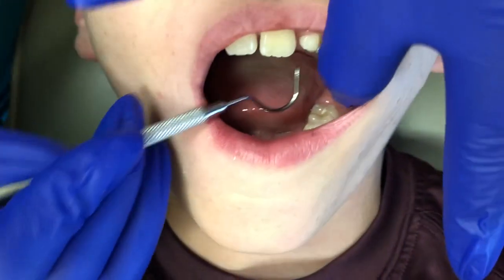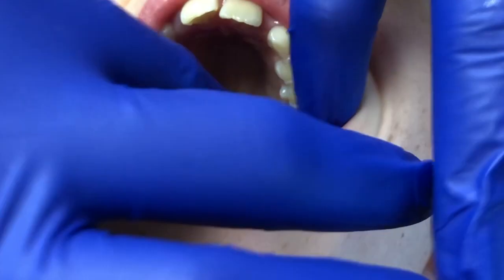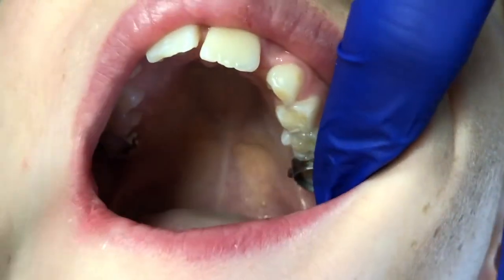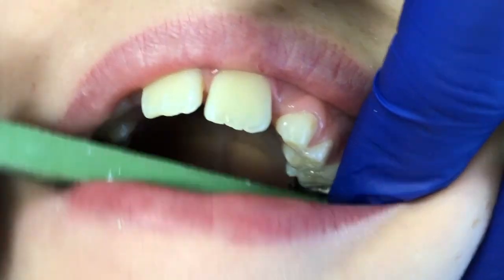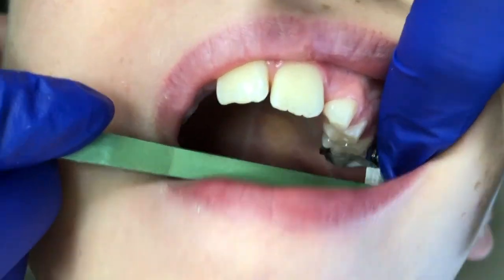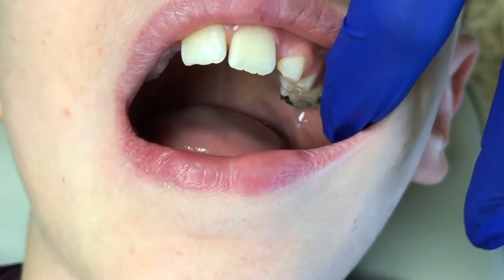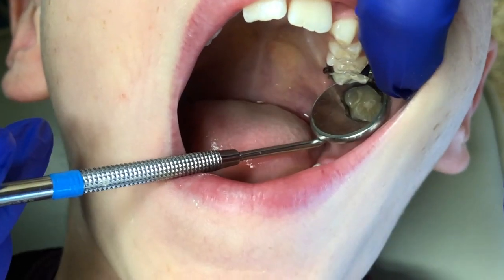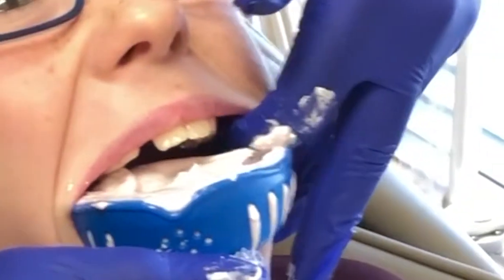So the first step that we will do is to place spacers so we can try on bands. We like to have the bands fit snugly, as you've seen in our last video with the molar bands. We make sure that it gets seated all the way down. Then we take an impression with the bands in. We call this a pickup impression.